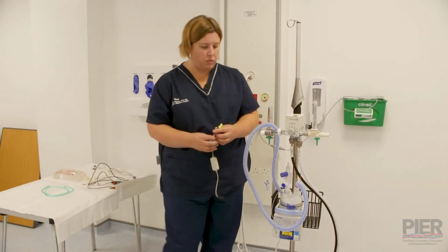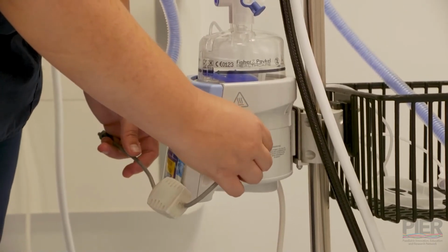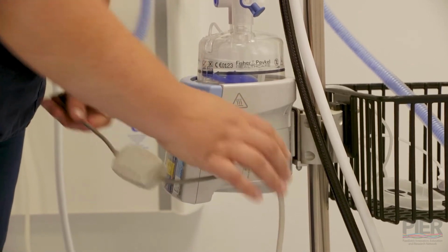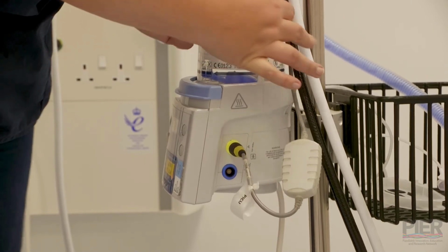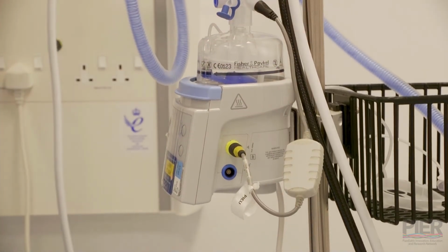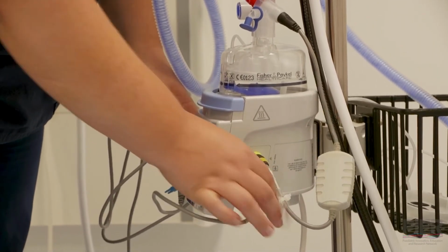Going to require temperature wires to be able to control the humidification for the circuit, and these come in two wires. The yellow one connects to the yellow section, just twist slightly until it slides in, and then this one attaches to the back of the patient flow circuit, and then the blue wire into the blue connector.